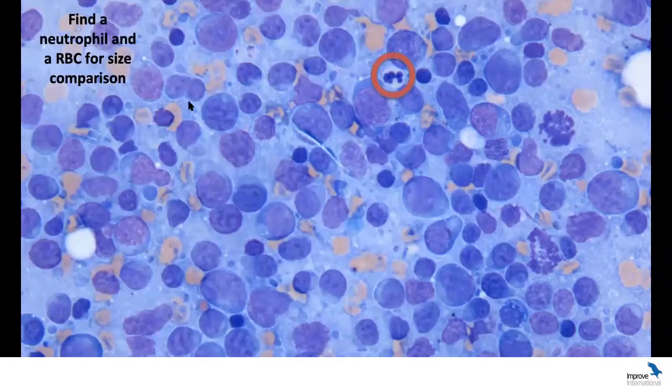It's well spread out. And so when we look at this, I'm going to try and compare these cells to the lymphoid cells. So here, this is a small lymphocyte just next to my neutrophil. So overall, the size of the cell is smaller than the neutrophil. And if I look to the nucleus, it should be 1 to 1.5 times the red blood cell in size.